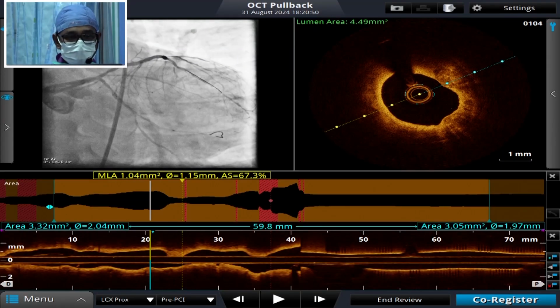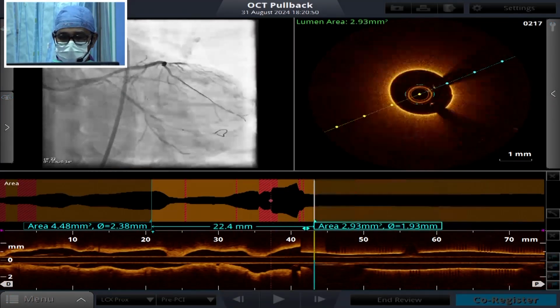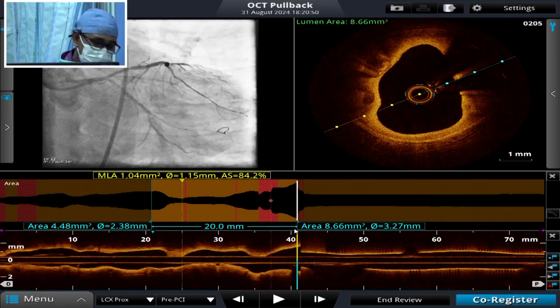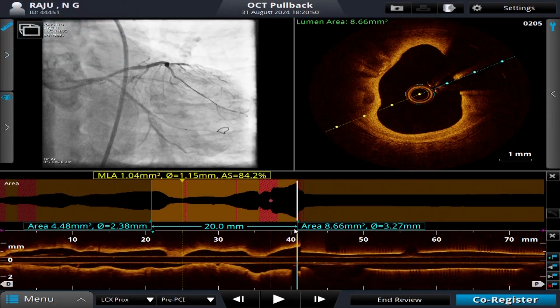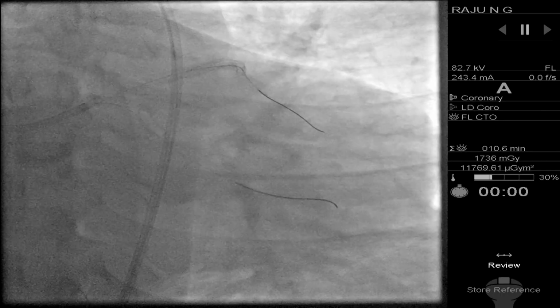So the stent length from here till the left main would be 18 or 23. I think we prefer 23. We'll go for a 3 by 23 stent in the circumflex. Prior to that, we'll do the balloon dilatation. Three balloon for the circumflex. We have taken it for LAD pre-dilatation, post-dilatation. Vishnu, we'll go into the circumflex and dilate it.